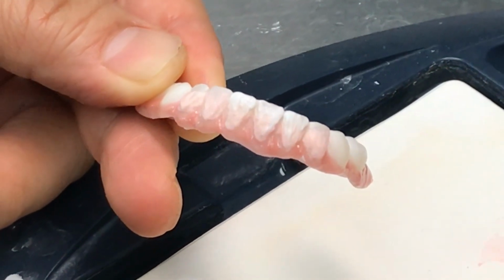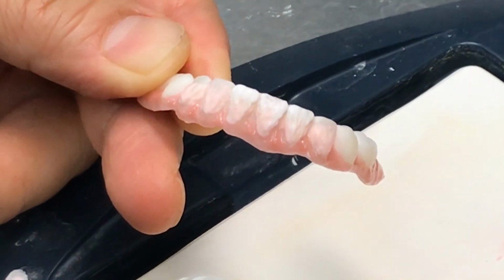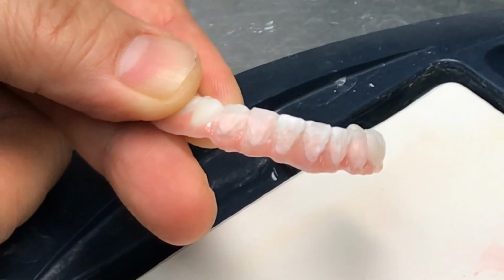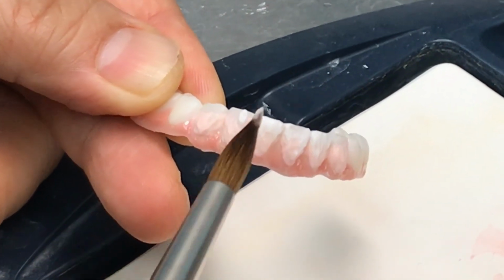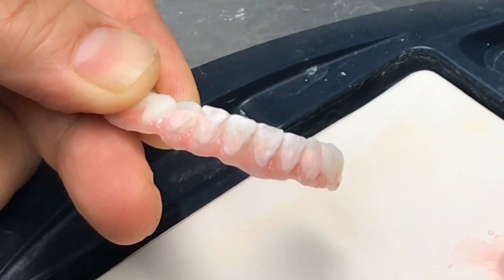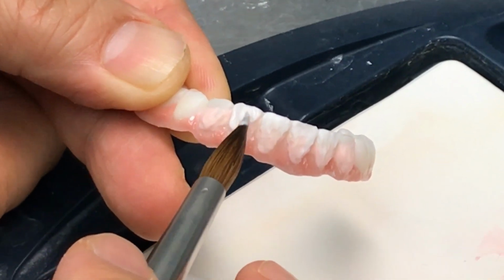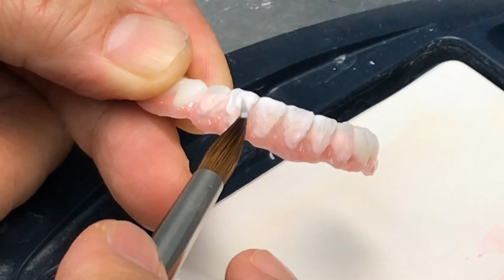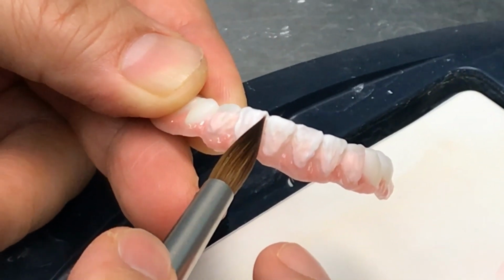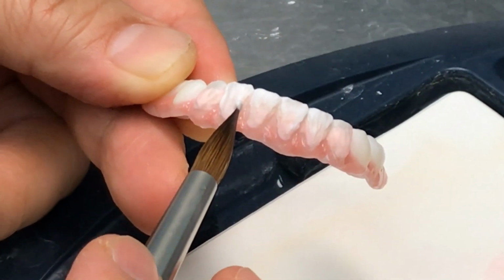So here's GC America initial GR porcelain. Here's the tooth width, another lateral, very little. So I'm trying to compensate the size width, like that. Overlap the underneath.